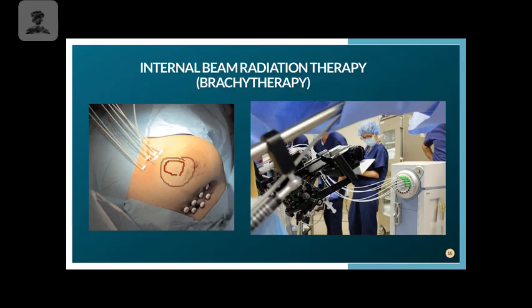And so what happens is they will push those catheters through, and once they push them all the way through, the catheter sticks out on the end, and you can see there's a little button at the end that helps close off the end of it. It's like a cap. Then at the open ends of the catheters, which are going to be outside the body, they can put in the radioactive source through the catheter, and it will go to the depth that they need for that tumor.